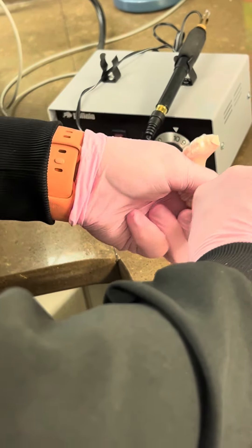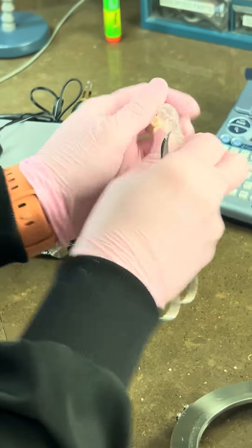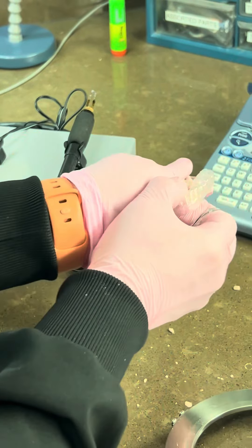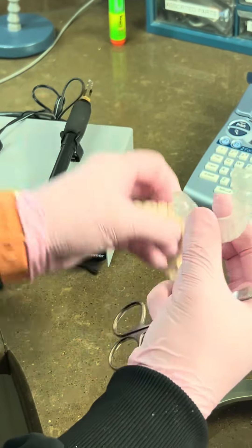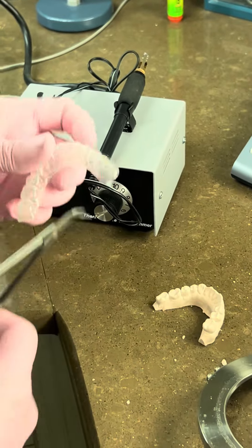We'll pop this off the model. Usually it makes a mess because this model will be destroyed by the time we get done with it. I thought they should keep those molds. We pretty much destroy them when we get them out. Can I have mine? If you want to — it's missing some teeth.